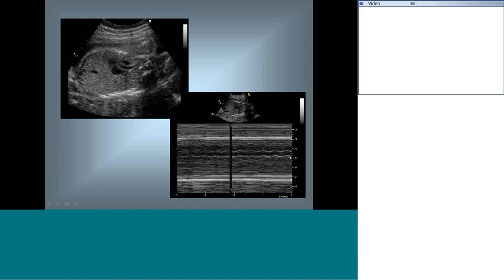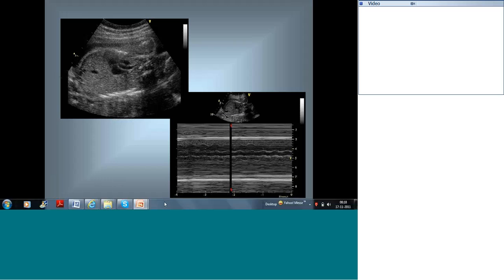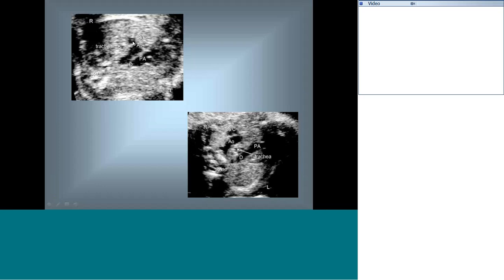The three-vessel view is routinely performed by radiologists, who use it to suspect heart problems. One important aspect not yet covered is the sidedness of the arch. Normally the aorta crosses from right to left side of the trachea. In the case of a right aortic arch, the aorta stays on the right side and the trachea is between the aorta and pulmonary artery — this finding should prompt careful evaluation for associated heart disease.